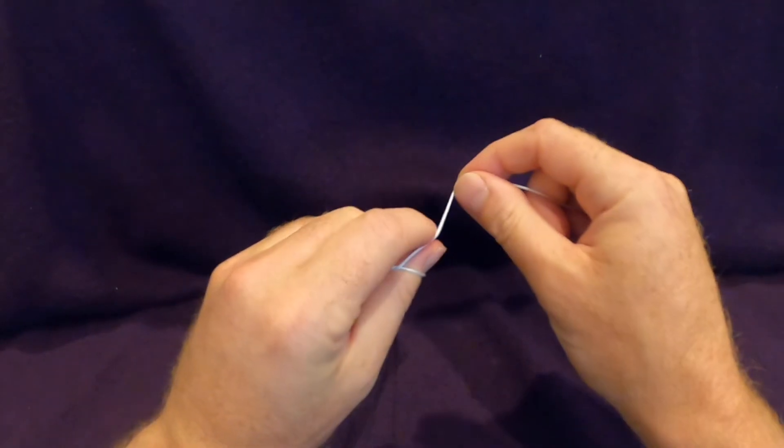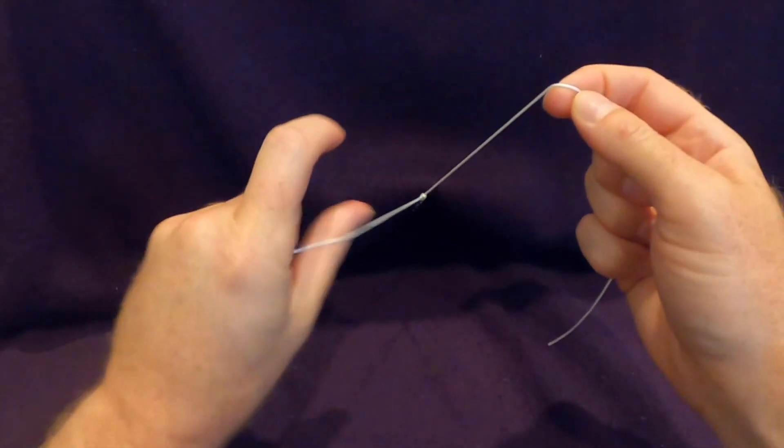Let's watch a few knots with the left and the right hand to get an idea of the overall feel of this technique.